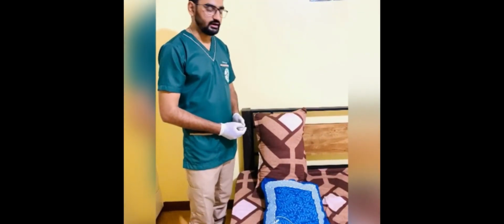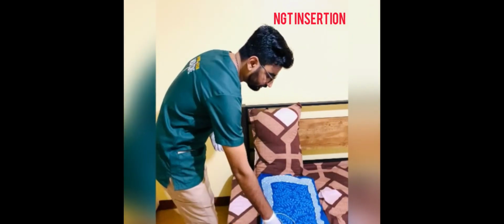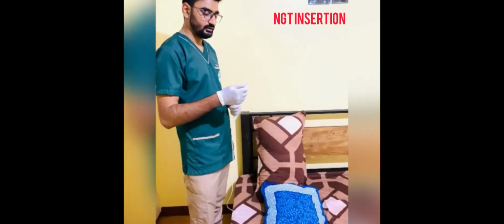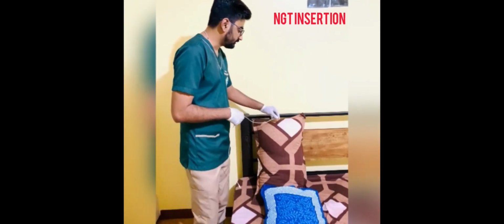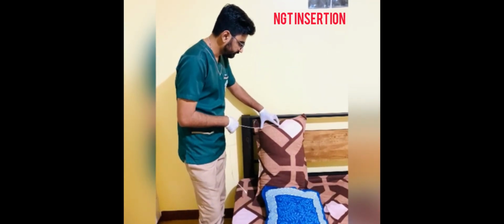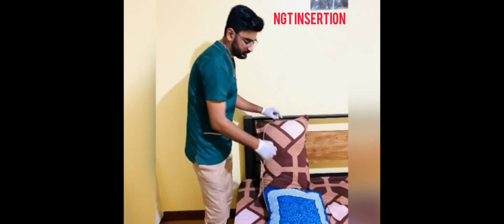So for nasogastric tube insertion, introduce yourself to the patient, ask consent from the patient, and then ask the patient to sit in upright position. Now use the NG tube and measure the desired length from the tip of the nose to the earlobe and 5 centimeters below the xiphisternum. Now measure the length.